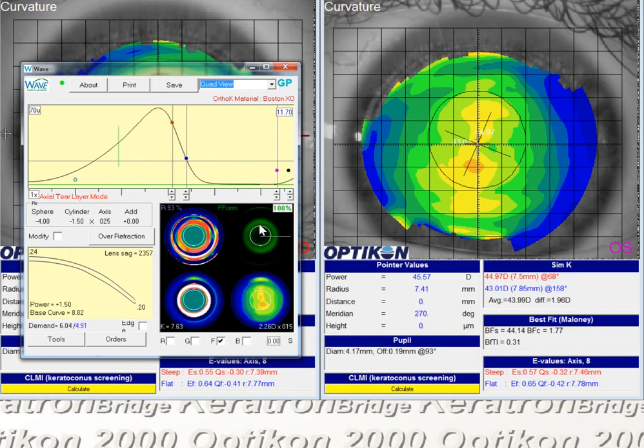So with this lens, the last thing I would do is what I mentioned earlier, steepen the vertical meridian. Wave lenses can sometimes have a tendency to sit a little bit loose in the vertical meridian, and if that lens is loose, it not only makes it more difficult to mold out some of the cylinder, but that lens can also even induce some with the rule astigmatism. And we definitely want to avoid that. We're trying to correct anywhere from a diopter to a diopter and a quarter of it.